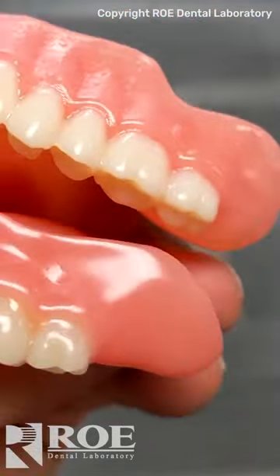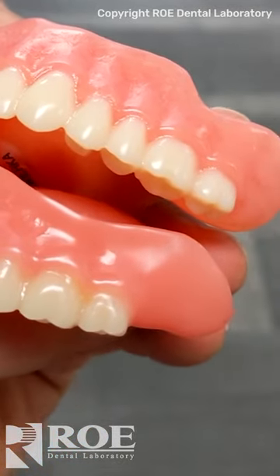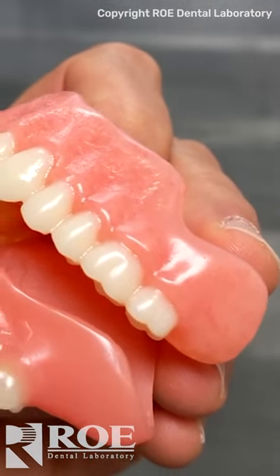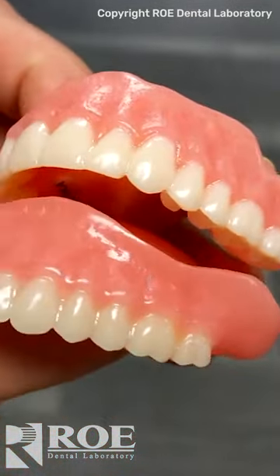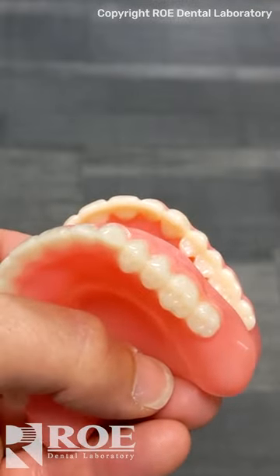Well, you tell because the one on the bottom is iVotion print on a carbon printer — there's no veins. But look up here, this is Lucitone. You can see the veins inside there because it came from a block. The bottom one came from a print from a bottle of resin, so it can't have veins. Otherwise, you can't tell.